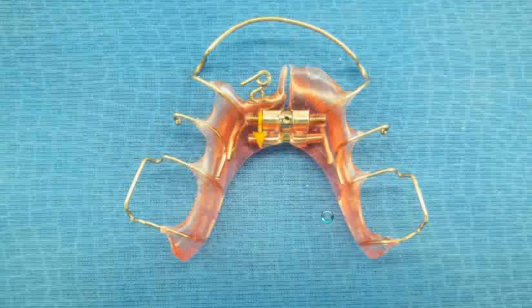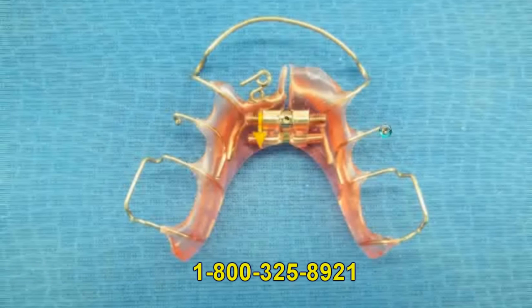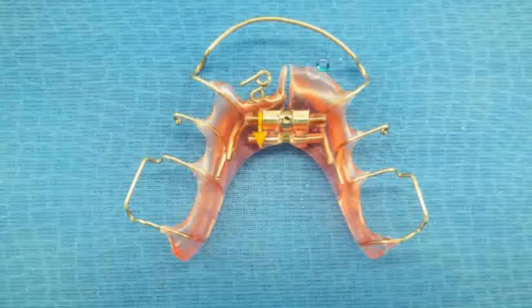The lower Schwartz has Adams clasps on the molars and ball clasps between the premolars. It has a labial bow, and we normally include a set of lap springs to help you round out the anteriors as the arch is expanded. In this case, we have included an individual finger spring to help move a tooth that is too lingual.